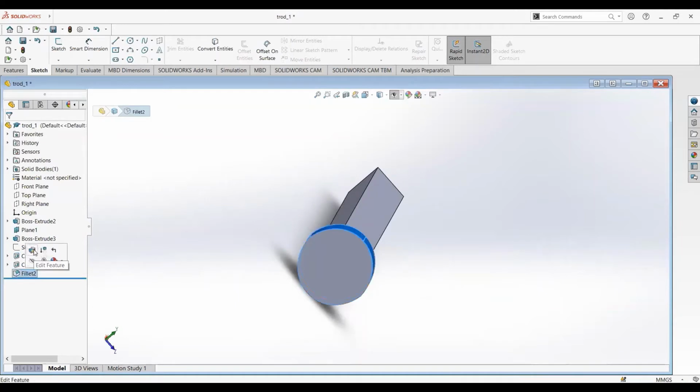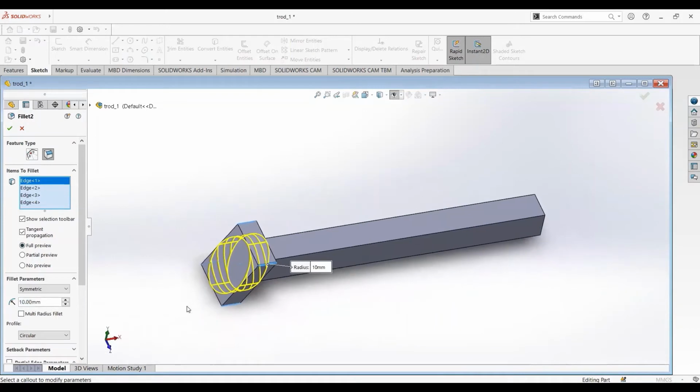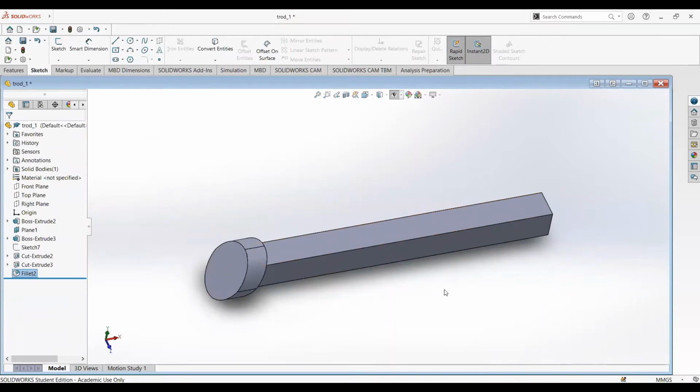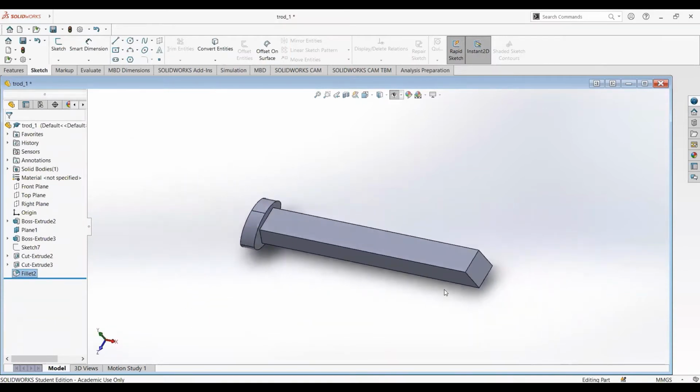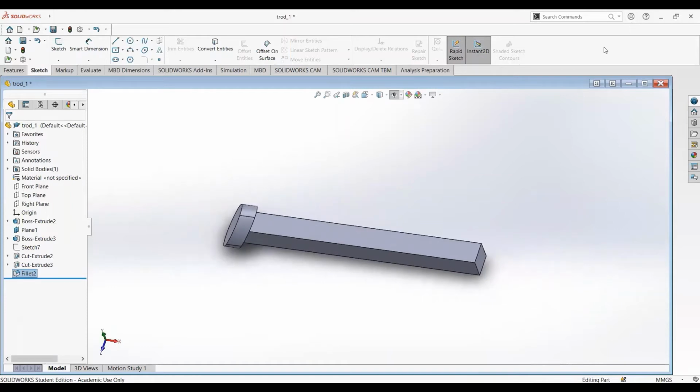After that, we used fillet because we wanted to make all the sharp edges as smooth as possible. So we give it a circular shape, which will make this part fit in our device better as well. This is what we did. Yeah, this is how we created the T-shaped rod. Now we're going to move on to the next part, and I'm going to show you how we created the bottom and top clamp.